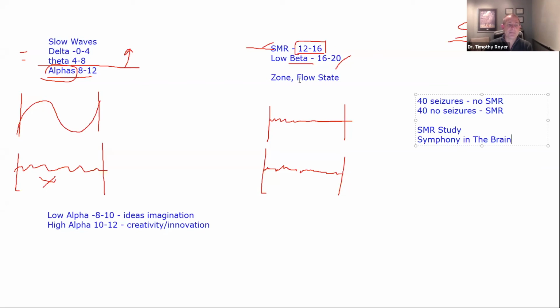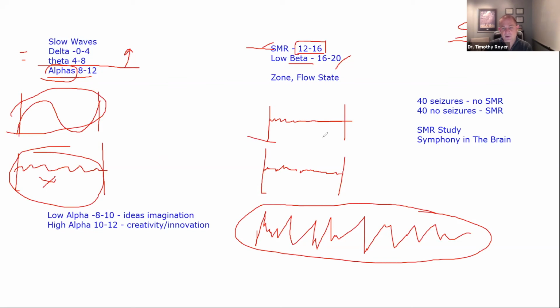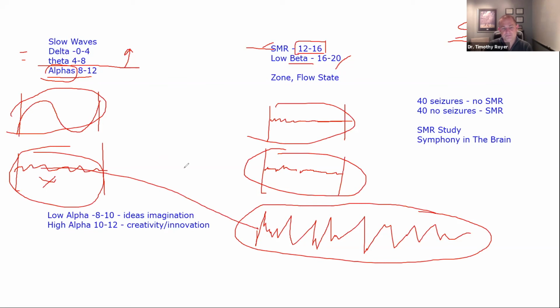To finish up, I mentioned earlier when we started that an EEG is this choppiness that we see, right? Well, all that EEG is a combination of all of these brainwaves brought together into one electrical signal, okay?